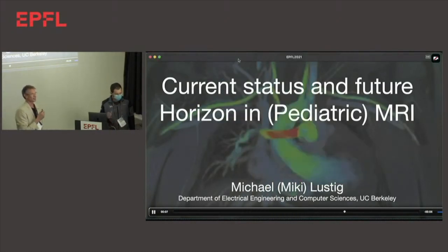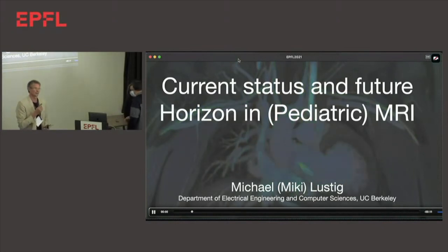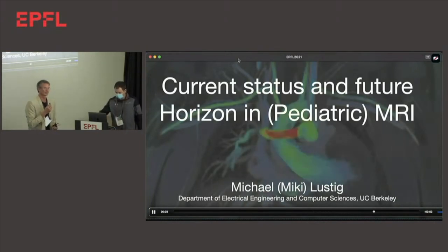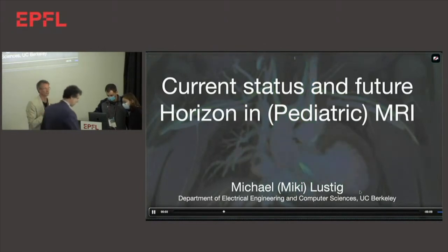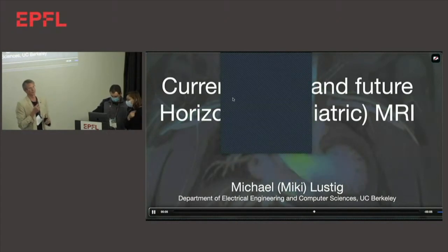Oh, well, that really depends on the brain region, right? And that is also why for many applications, I think PTX doesn't matter, because rarely, if you want to push for these really high resolutions, especially for functional acquisitions, do you necessarily want to have whole brain. You can still get a long way with just doing a simple B1 shim, RF shim, whatever, on the brain region that you're mainly interested in. Just move your weak spots around.